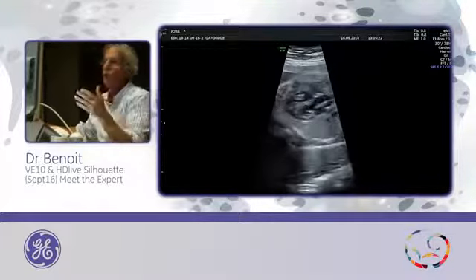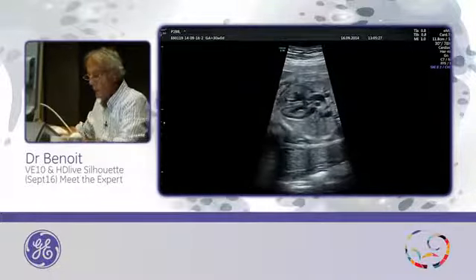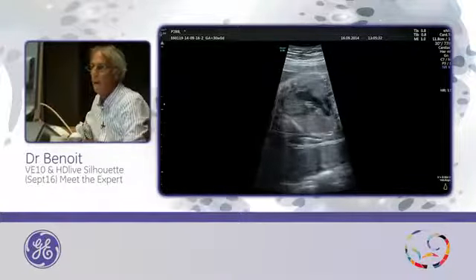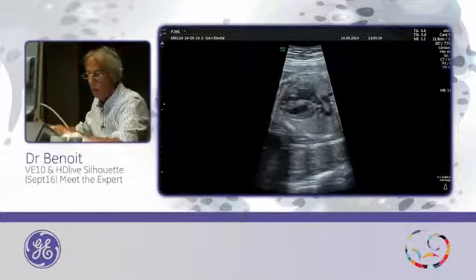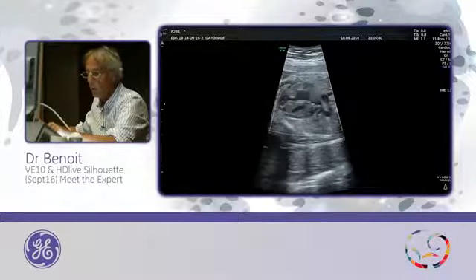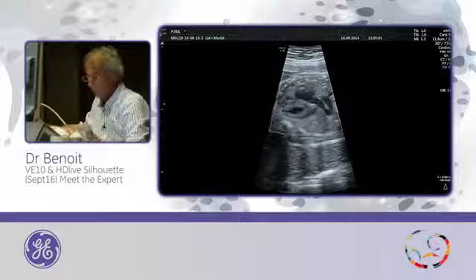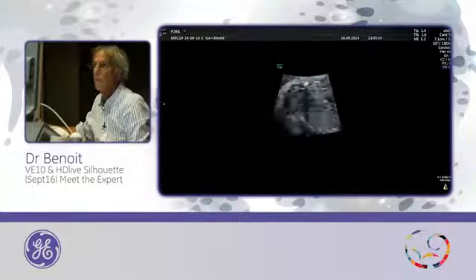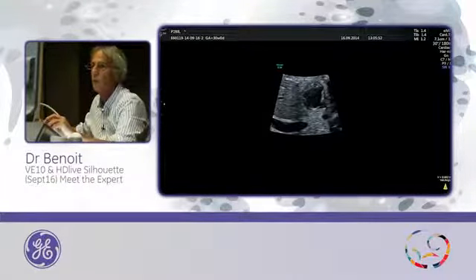So for the heart, you can do a 2D examination. You can do acquisition with STIC, and with the STIC, the acquisition is quite fast. I will do it with quality high, volume angle, I will choose 40. Now I start. So this is the acquisition, and you will see the quality of the STIC. It's really good.